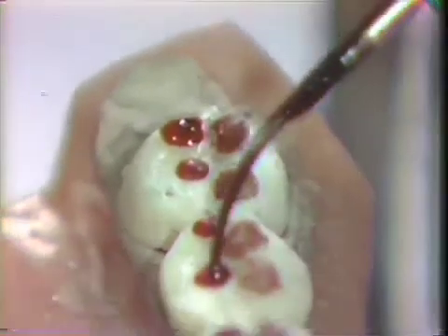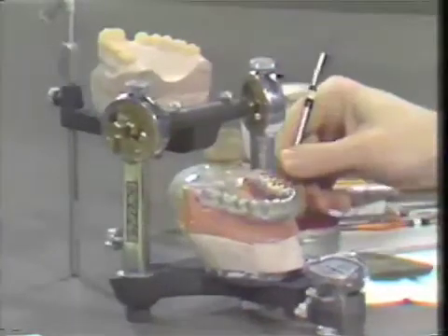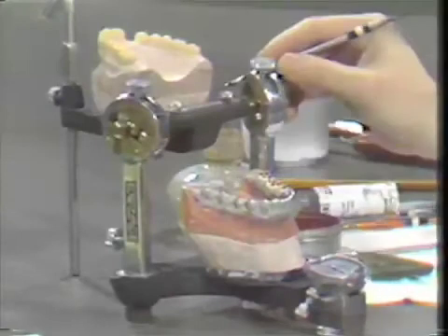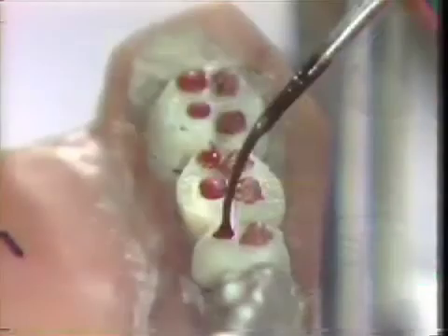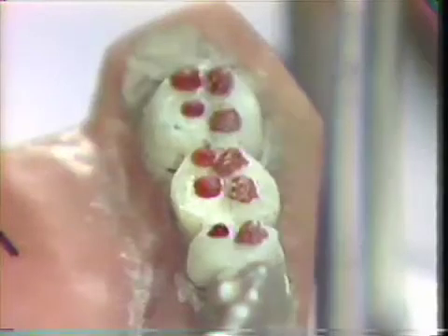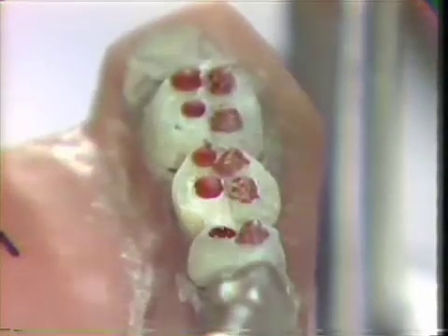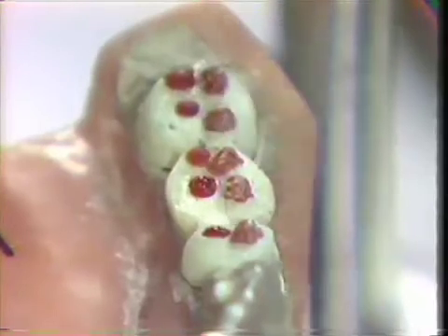We will then again dust this with zinc stearate, close the articulator to ensure that we have these positioned in the proper relationship. It's most important at this stage, when working against the anatomical cast of the maxillary arch, to be sure we have these cusps positioned exactly where we want them, because the rest of the waxing procedure will depend upon positioning of these cusps and supporting cusp areas. We'll now dust this with some zinc stearate. And again, close the articulator.